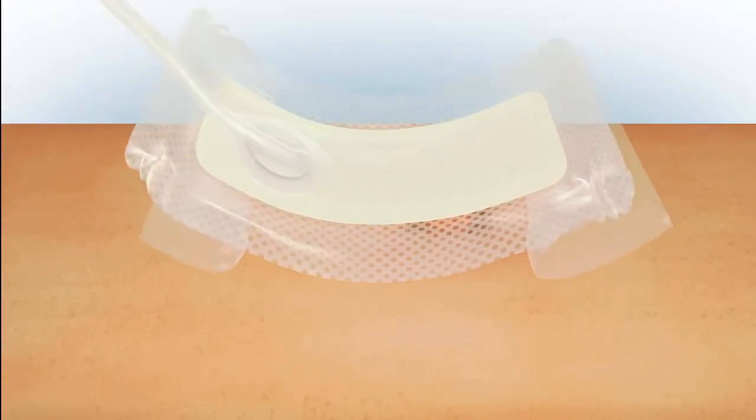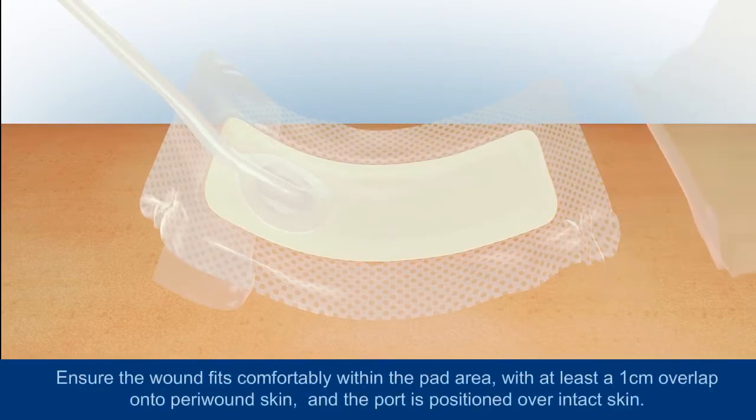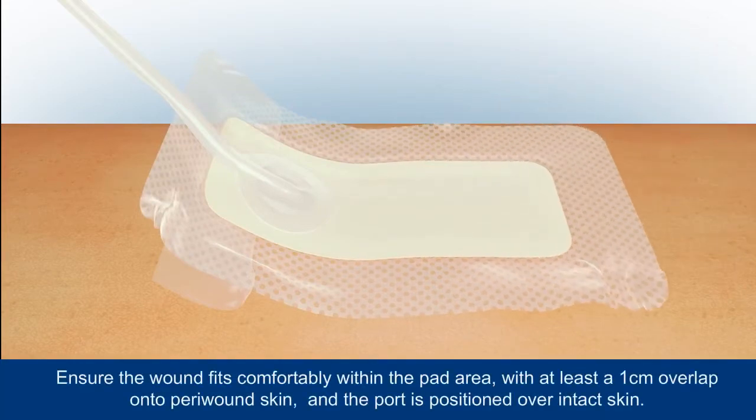Partly remove the backing from the dressing and position over the wound. A moderately exuding wound would take up no more than 25% of the pad area. Place the dressing centrally and flat over the wound and surrounding skin, making sure that the port is positioned away from the wound and is uppermost over intact skin. It's important that you don't place the port directly over the wound.